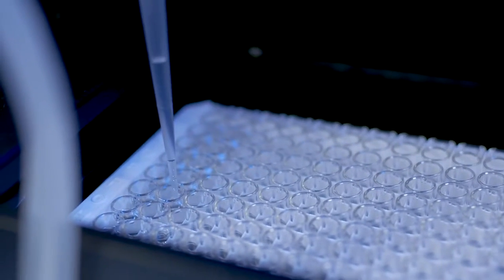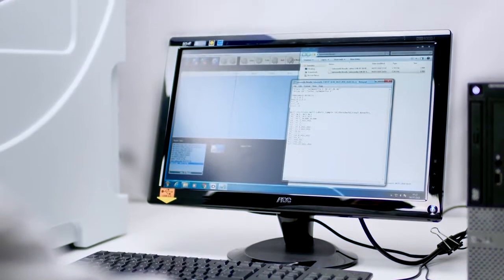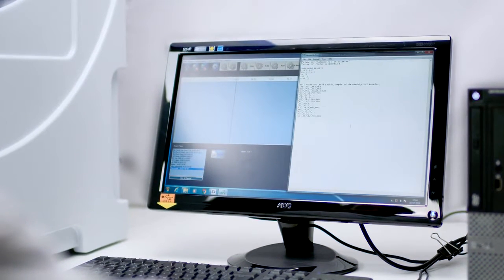Finally, the stop solution is added and the plate is read. The software displays the test report which can be viewed and printed. The data and results can be exported to LIMS as a CSV file.